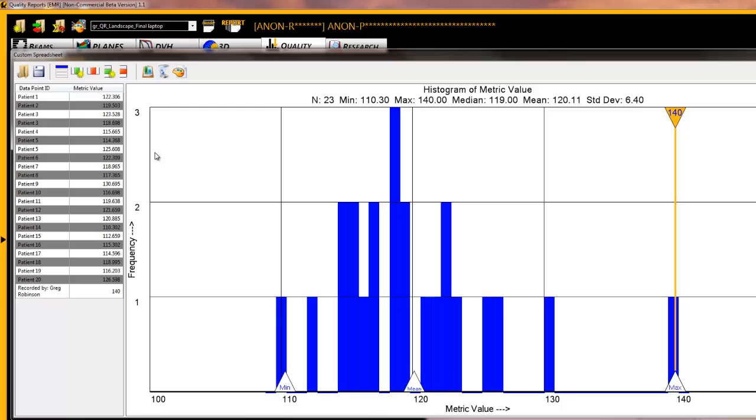But in terms of establishing a quality system for continual improvement, we have proven through work with many institutions and also within our own company at ROR that establishing some type of measurement on plan quality allows you to improve and establish benchmarks which you can track over time. And that's really all this performance record is.